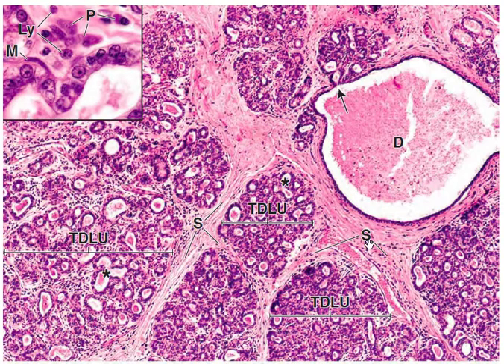The connective tissue within the lobular unit is a typical loose connective tissue that is now more cellular, containing mostly plasma cells and lymphocytes. The alveoli are well developed and many exhibit precipitated secretory product. Each of the alveoli is joined to a duct, although their relationship can be difficult to identify. The epithelium of the intralobular ducts is similar in appearance to the alveolar epithelium.